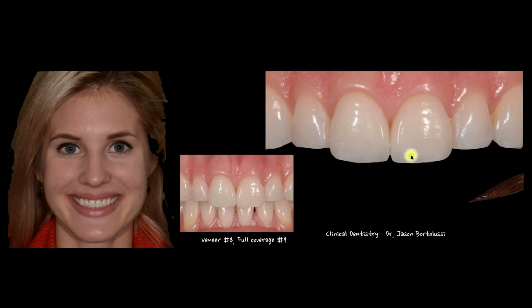And the distraction here, if you look back, this lateral appeared to be more of a visual tension in the original photograph. How did I break that visual tension? I wasn't doing the other lateral. I did it by changing the incisal edge. Look at the incisal edge here and how well it flows with the adjacent tooth. And then notice there's a discrepancy in this incisal edge, just a little bit more of a chip out. And notice how that chip out fits more of the chip out that you see here. So sometimes just breaking the visual tension with something else is really what makes it the best version of how we do things. And that's really important for us.